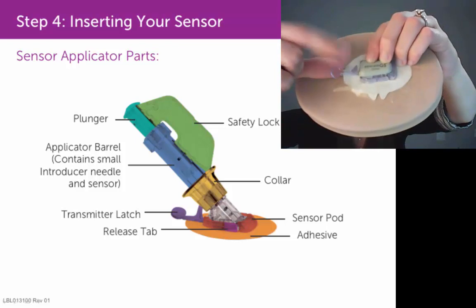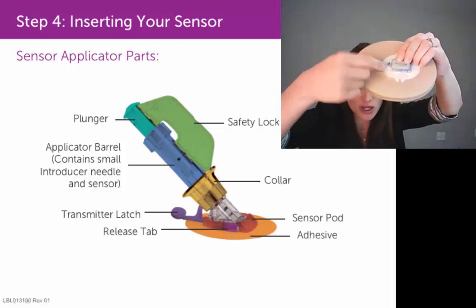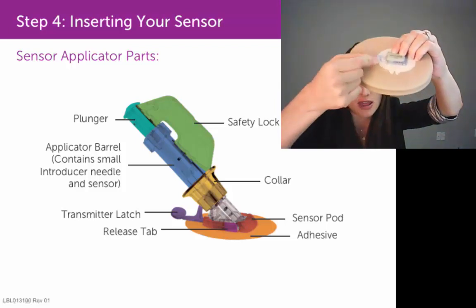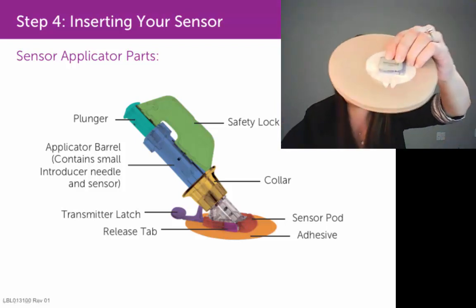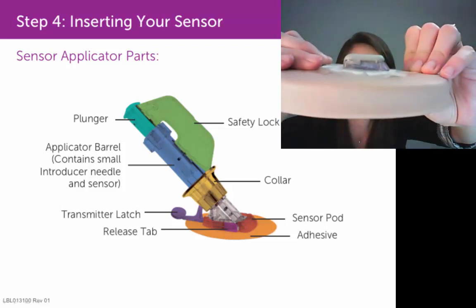You then want to remove this transmitter latch. Grab onto it and, with a twisting motion at your wrist, twist. That will break off the latch so that it just leaves that sensor pod and transmitter on your skin.